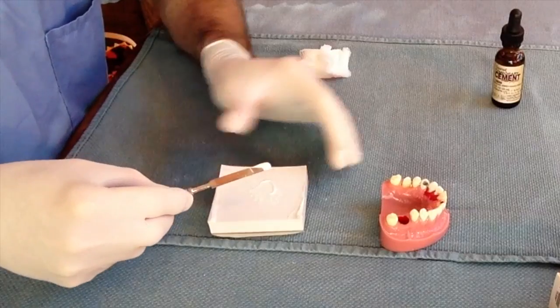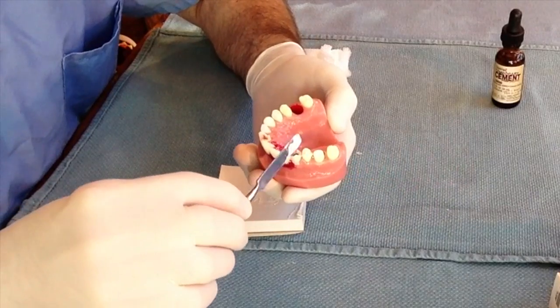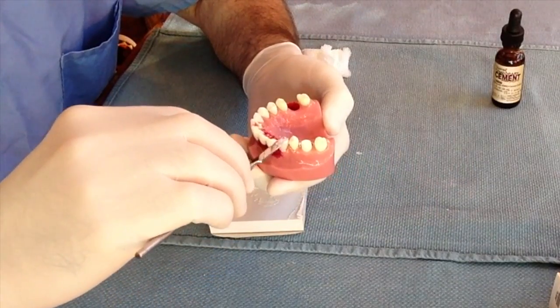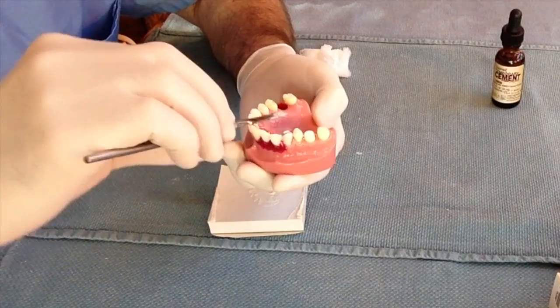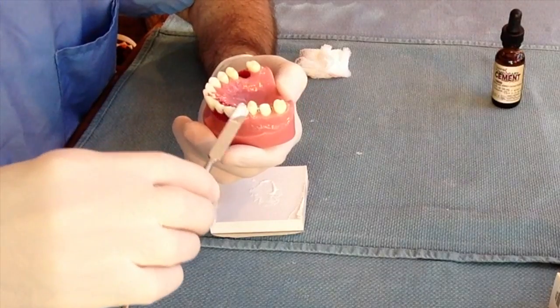Make sure the tooth is dry before applying the Temerex to the affected tooth. The caries should be entirely covered by the paste. Have the patient keep their mouth open until the paste dries and hardens, approximately 10 to 15 minutes. A bite block made of rolled up gauze will help the patient keep their mouth open.